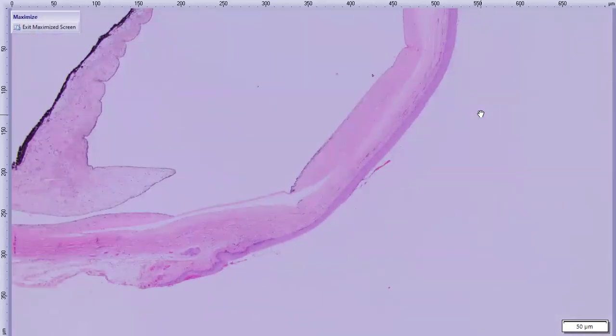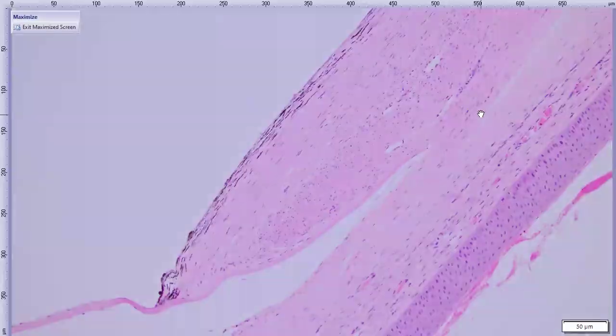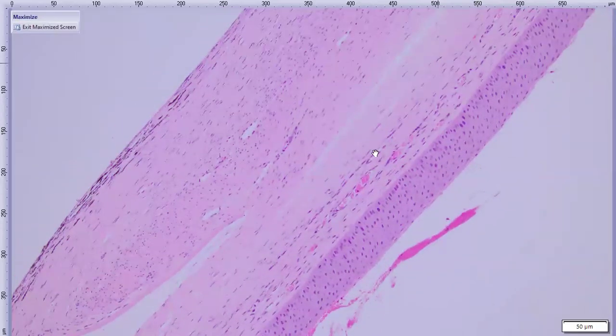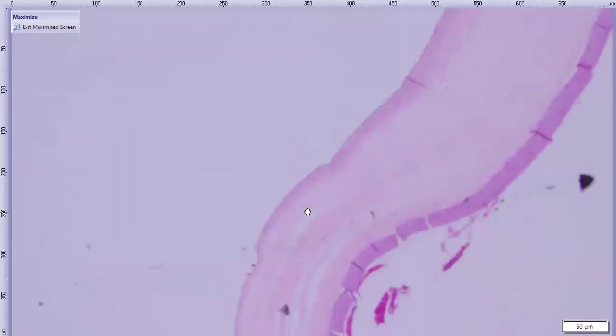So starting up front with the cornea, I swear we're not ignoring the elephant in the room for long. We have these large areas with breaks in Descemet's membrane. Here we have Descemet's membrane, and then it just abruptly ends. And that end is embedded in this really robust, deep corneal fibrosis. The cornea itself is pretty heavily vascularized. You can see the stroma here is vascularized. And those breaks in Descemet's, here's the other end of Descemet's picking up again, are ultimately multifocal.